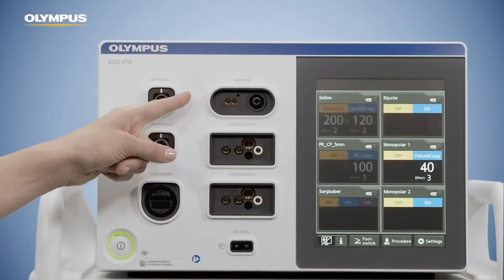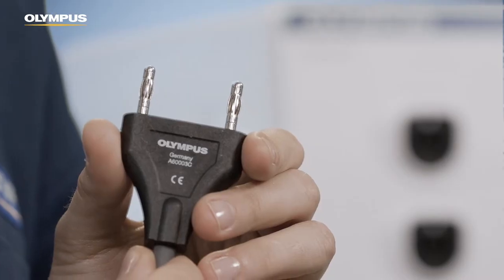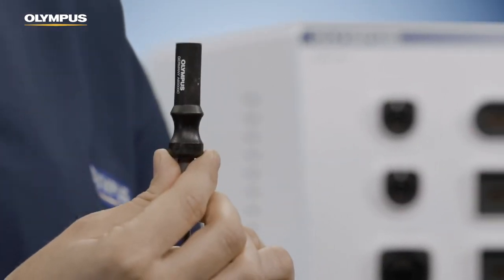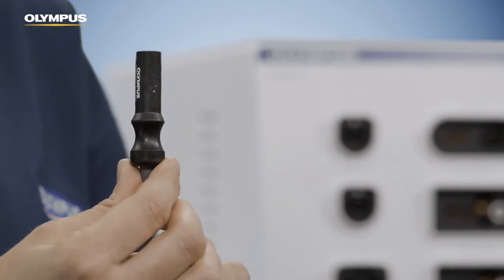To the bipolar socket, different plugs can be connected. It is possible to use two-pin plugs with either 22 or 28.6 mm pin space. Also, coaxial plugs with an inner pin of 4 mm and an outer diameter of 8 mm can be connected to the bipolar socket.